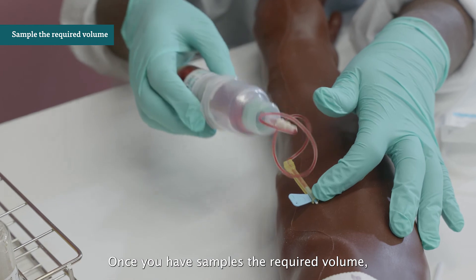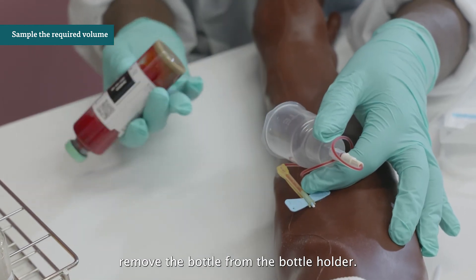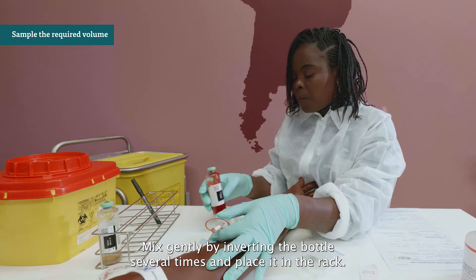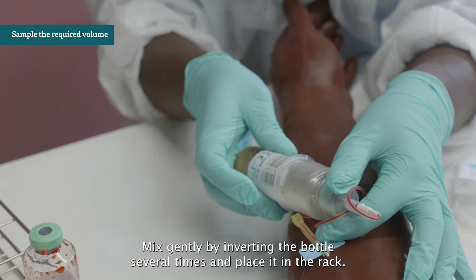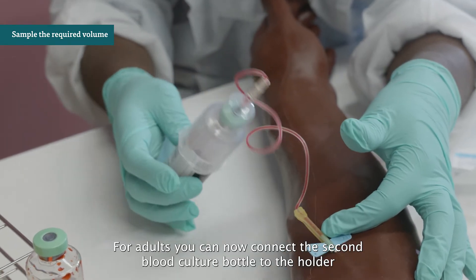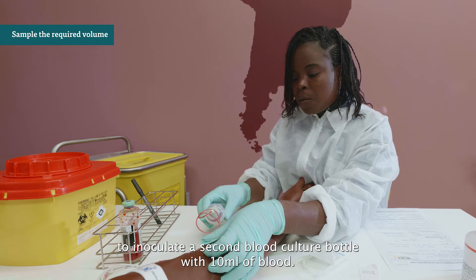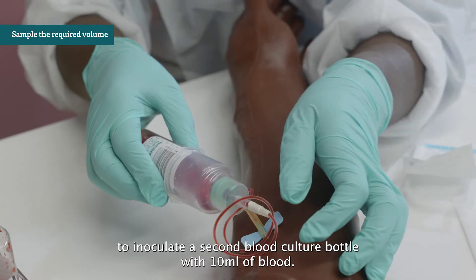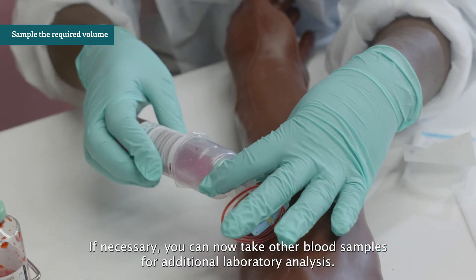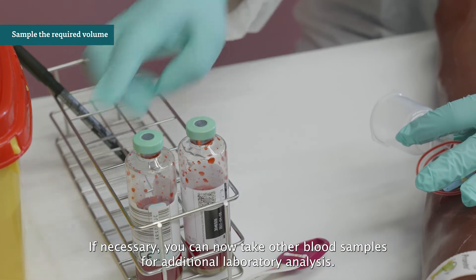Once you have sampled the required volume, remove the bottle from the holder. Mix gently by inverting the bottle several times and place it in the rack. For adults, connect the second blood culture bottle to the holder to inoculate it with 10 ml of blood. If necessary, you can now take other blood samples for additional laboratory analysis.